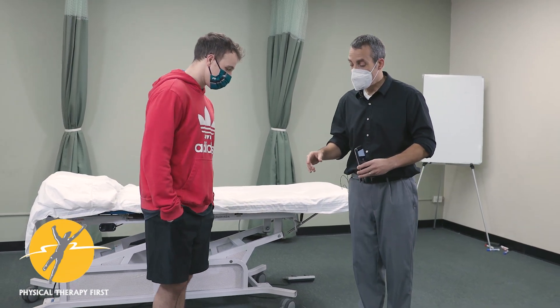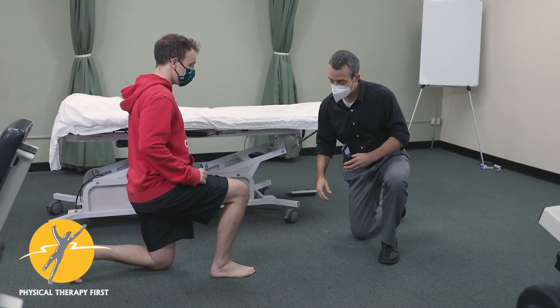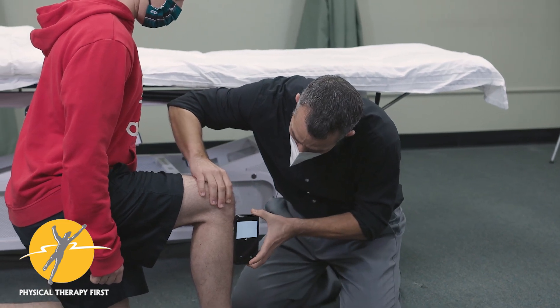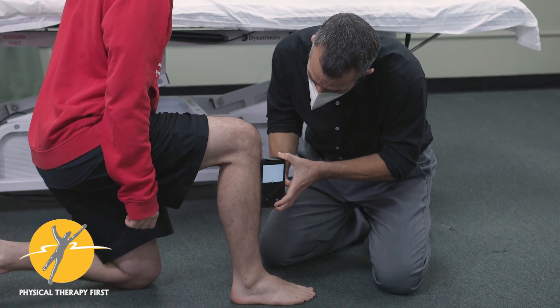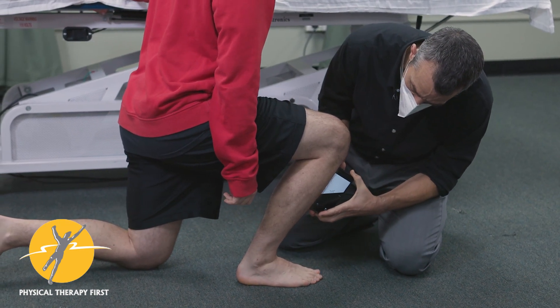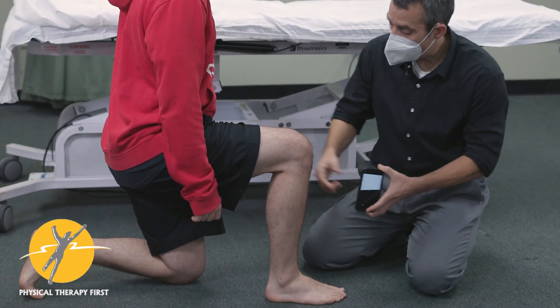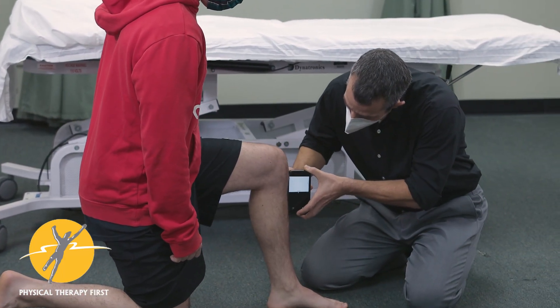A quick way to measure dorsiflexion is to have the patient in a kneeling position, then place the inclinometer right around the tibial tuberosity. Start at your zero measurement, then have them lean forward until they reach their barrier. For him it's 39 degrees.